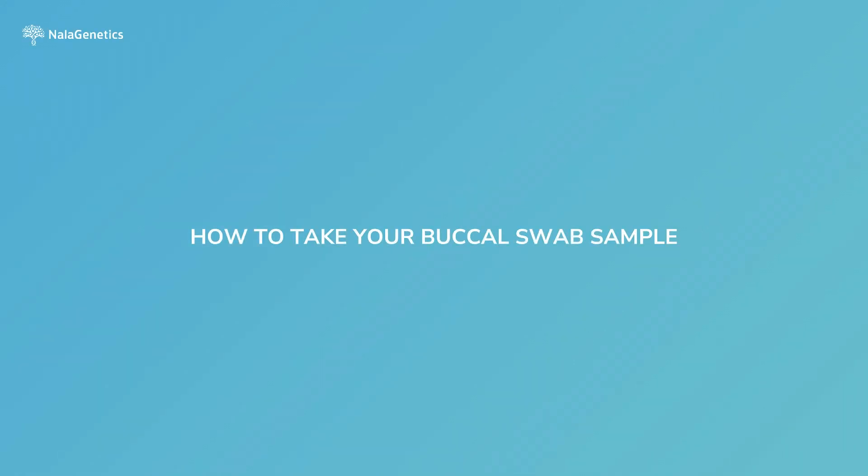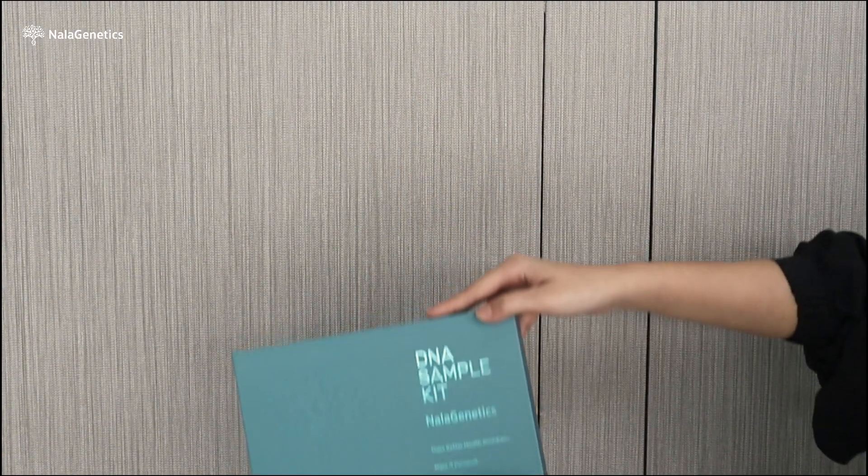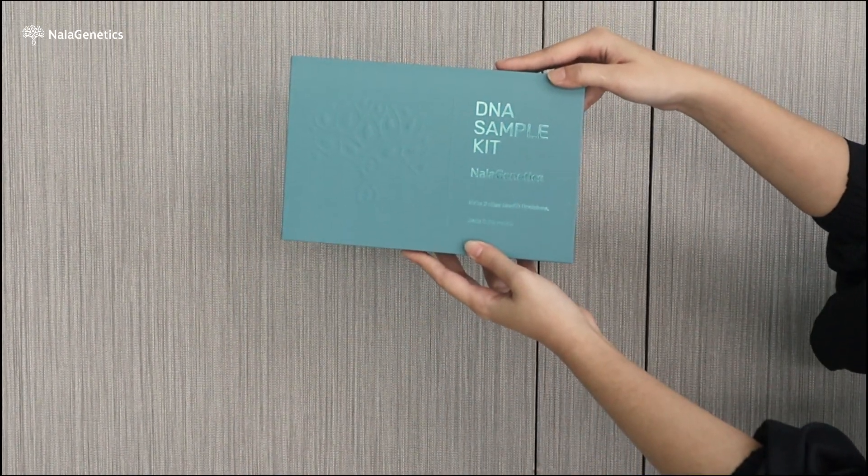Thank you for trusting NALA Genetics to be your partner for a better health journey. We will walk you through the step-by-step process of sample collection.